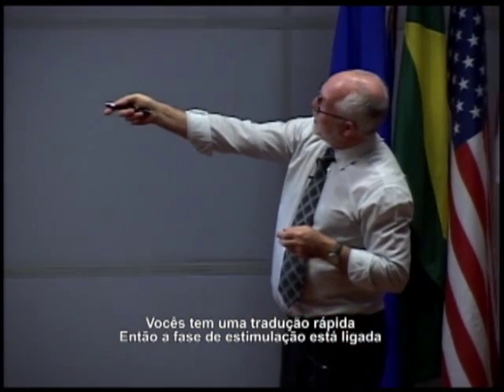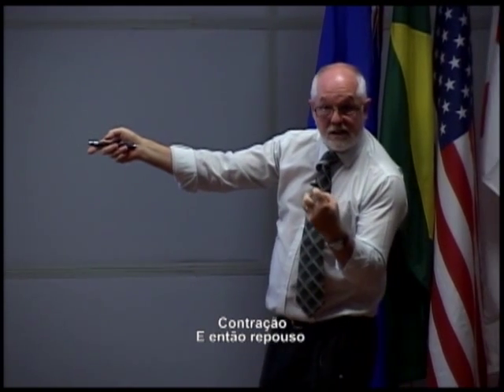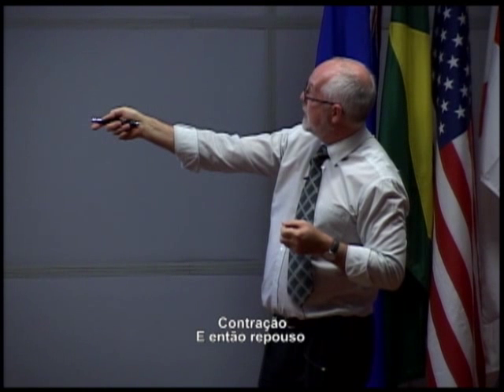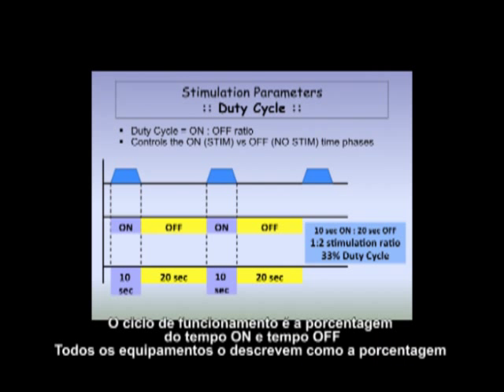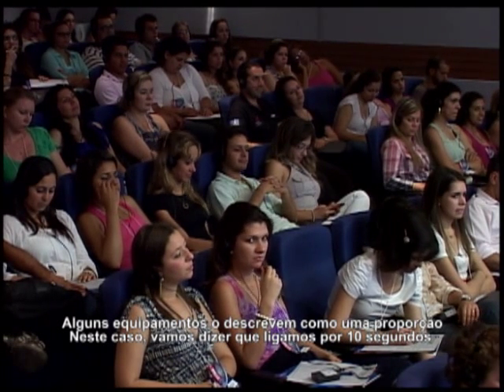Okay, so your stimulation phase is on, contraction, and then you have a rest. Your duty cycle is the ratio, the percentage between your on time and your off time. Some machines describe this as a percentage. Some machines describe it as a ratio.